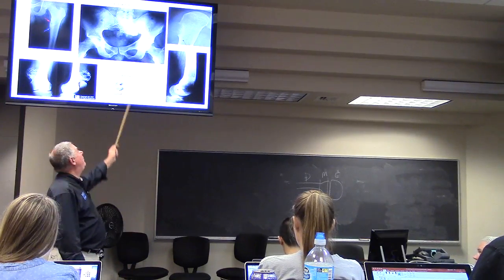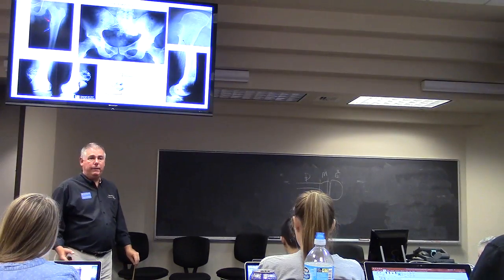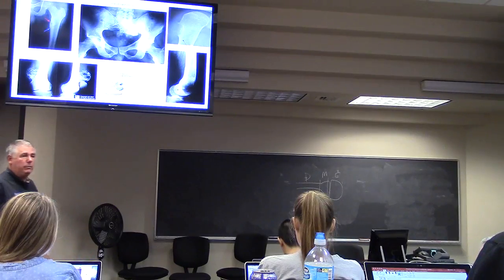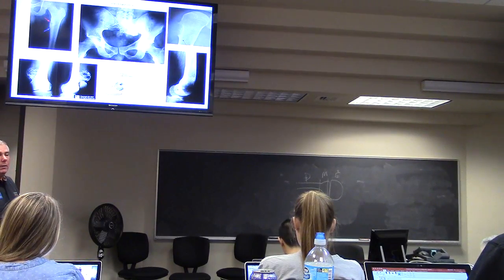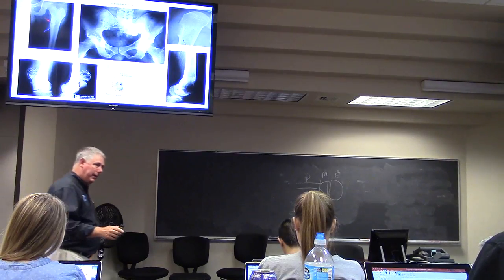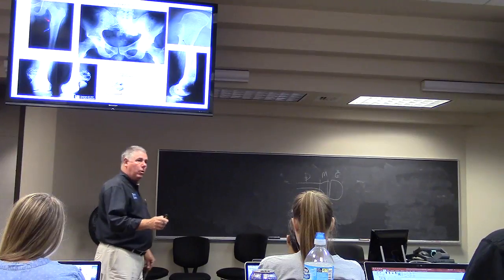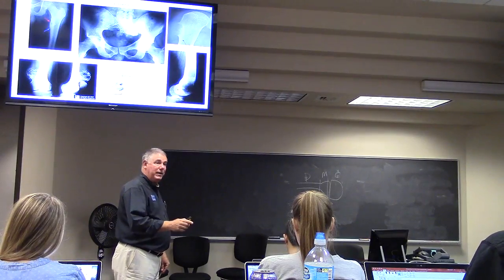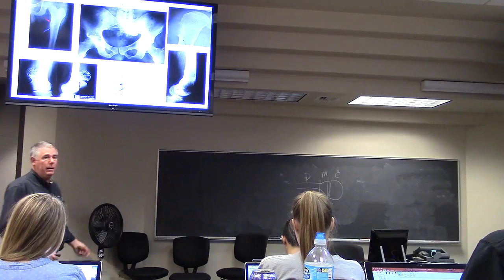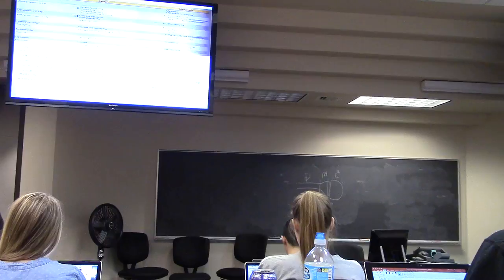This is one example, though, of what you can find on a plain film with a patient presenting with chronic low back pain. So there's no indication to x-ray the spine if it's ligamentous or chronic back pain like that, or disc related. But if you're thinking it could be bony related, then yeah, they have value there.